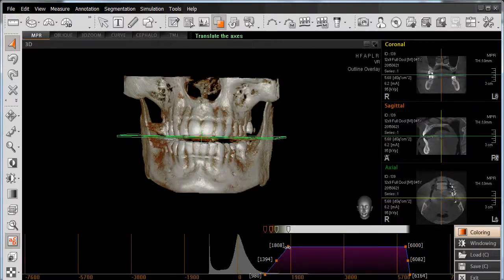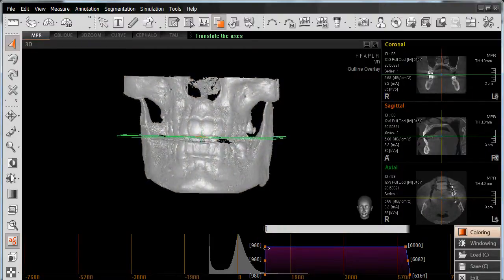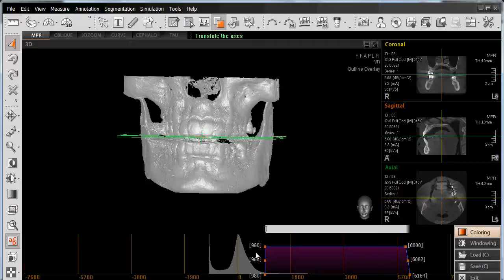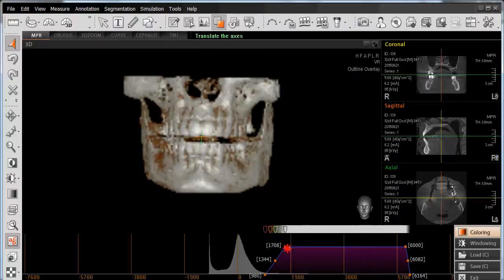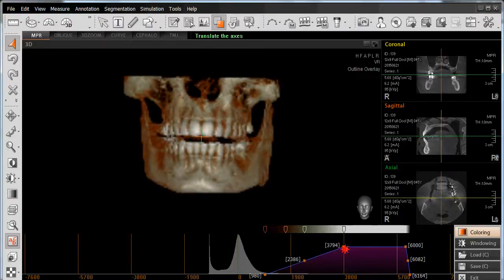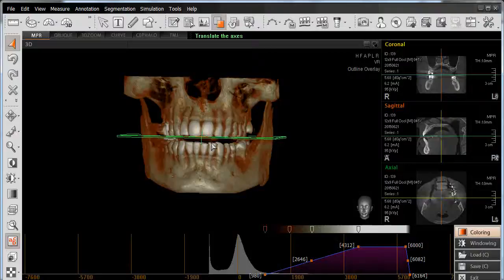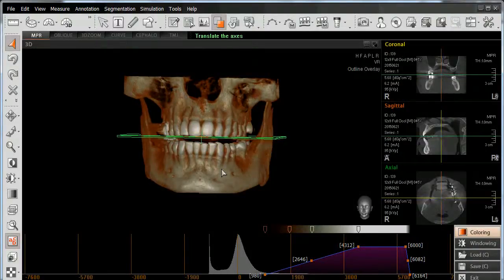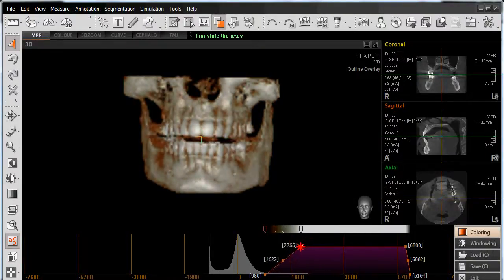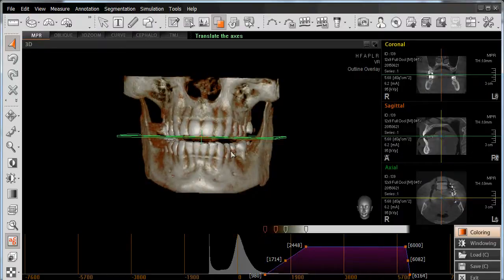As an example, I'll position the mouse at the top of this box, left-click, and slide it to the left until it's vertical. I've now indicated to the software that any density above this number should be white. If I want to apply color and create a sense of depth, I'll left-click and slide to the right. Now I've added more color to my view, enhancing the sense of depth of this 3D anatomy. This is more subjective, so feel free to use this tool until you find a color range that you find appealing.